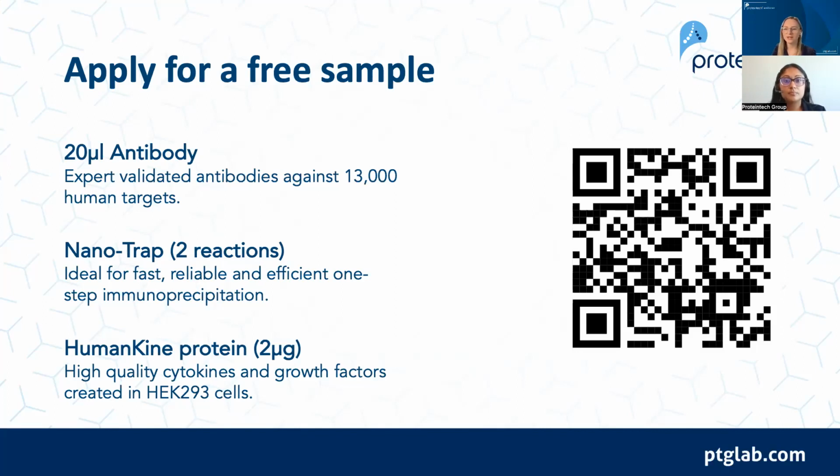Again, that can be really hard, especially if you're in tissue. But I know some clinical samples are moving now towards using, I think, acetone as a fixative. So there are lots of different fixatives out there. Also look at the literature, see what your colleagues are doing in similar experiments and similar tissue. How are they preparing their samples? As I said, everything that I've learned over the past few years at Proteintech is that sample preparation is by far the most important thing that you can do. Down the line in the workflow, you can do little tweaks, but you have to ensure that your sample is prepared in the best way. That's either isolating it really quickly and fixing it in the correct fixative, and a sufficient amount of fixative as well.